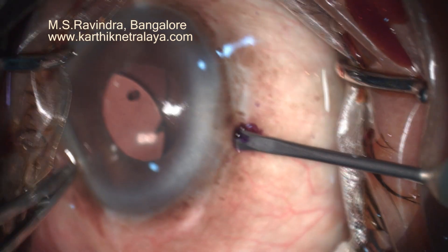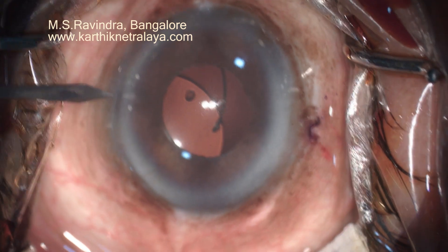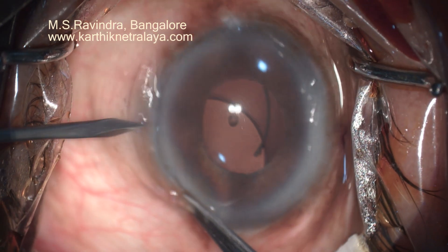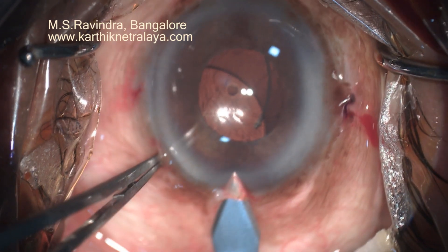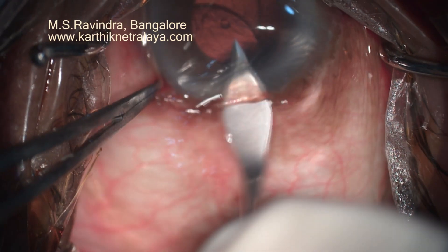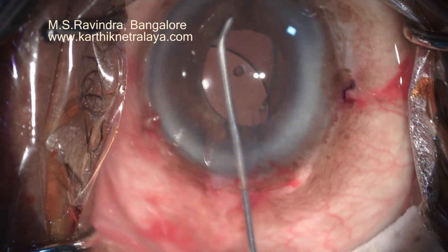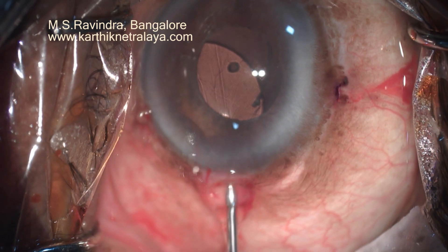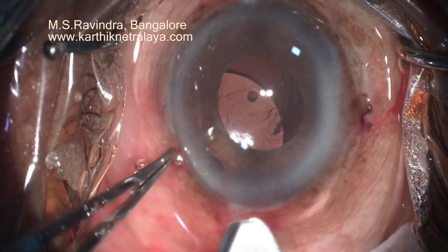After enjoying perfect vision for 35 years after initial cataract surgery and intraocular lens implantation done here, this nice gentleman presented with sudden onset of blurry vision and diplopia. He had a subluxated lens with round pupil and extremely clear media. The technique used at that time was extracapsular cataract surgery with intraocular lens implantation.